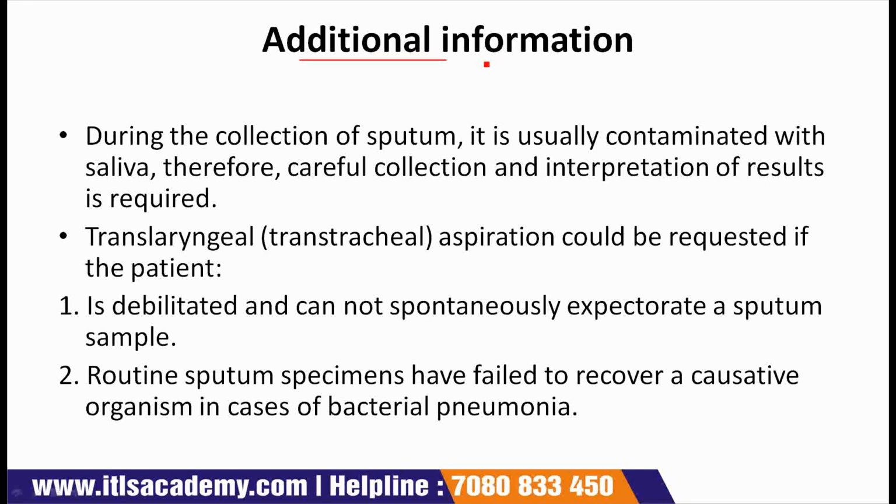Some additional information regarding sputum culture test are given. First one is during the collection of sputum, it is usually contaminated with saliva. Therefore, careful collection and interpretation of results is required.